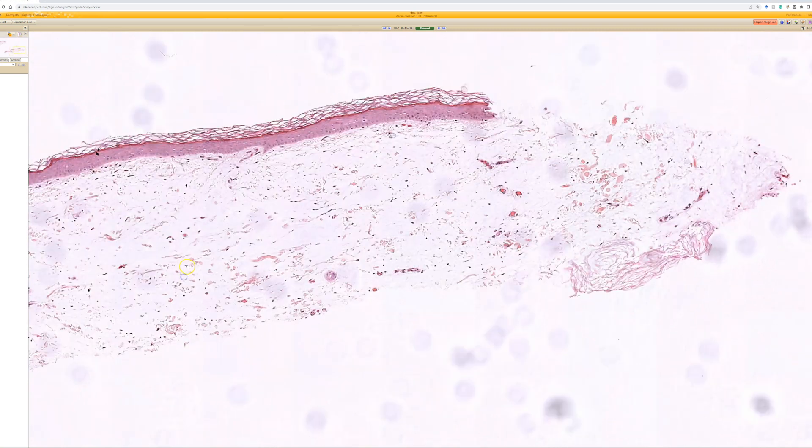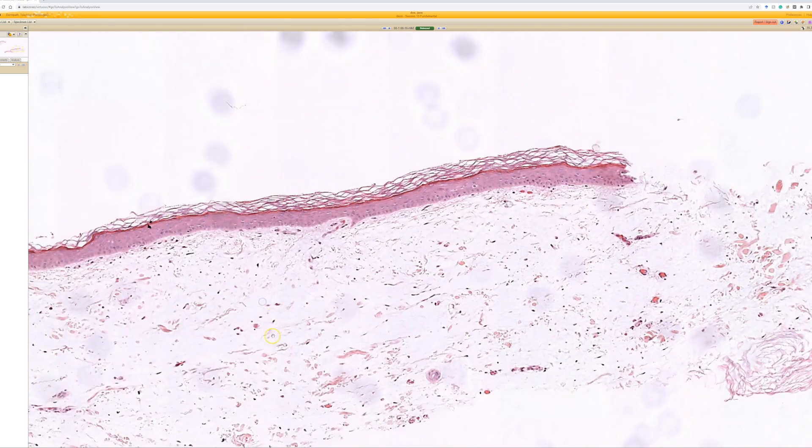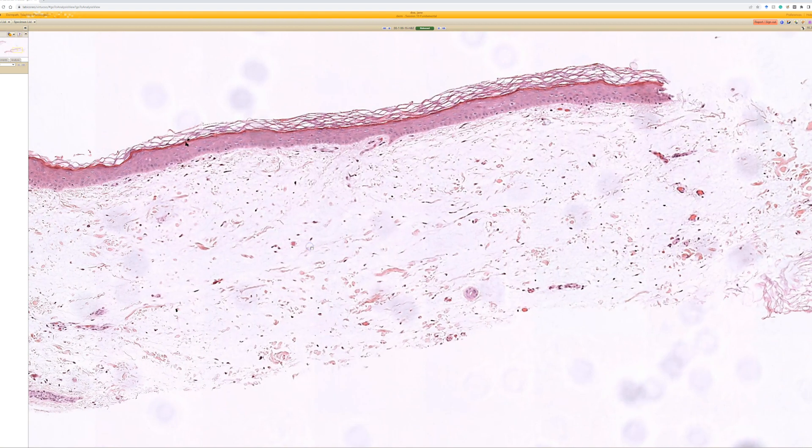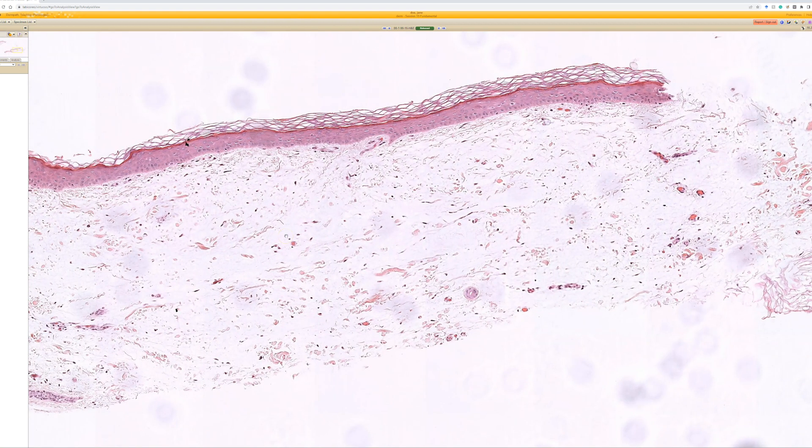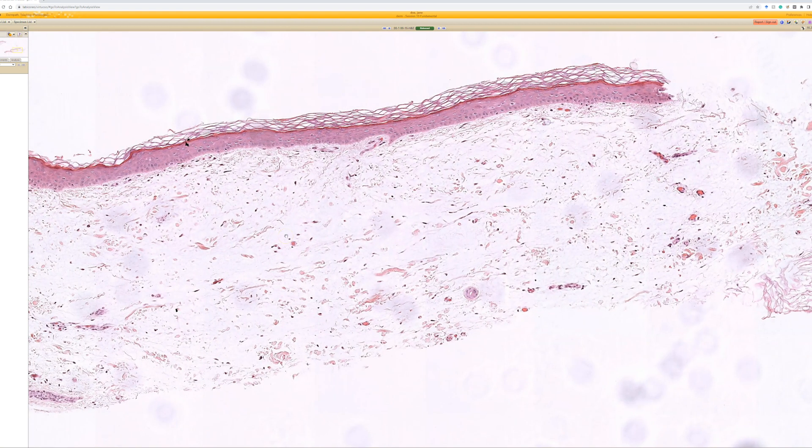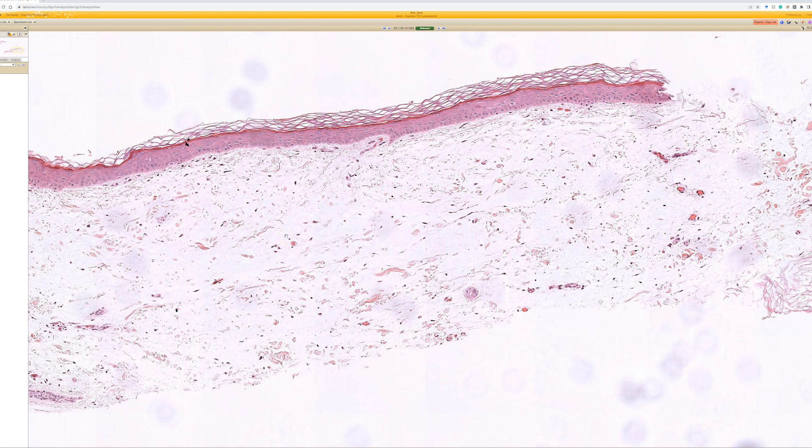If you just gave me a punch here and told me it was from the pre-tibial area, then I'd tell you this would be great for pre-tibial myxedema if it was nodules or diffuse plaques on the shins. So the clinical really matters here.